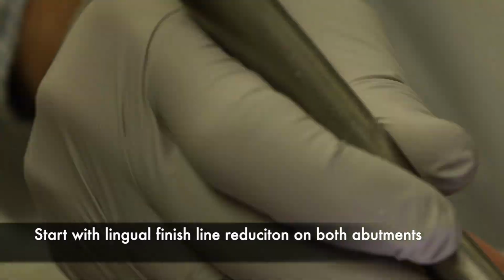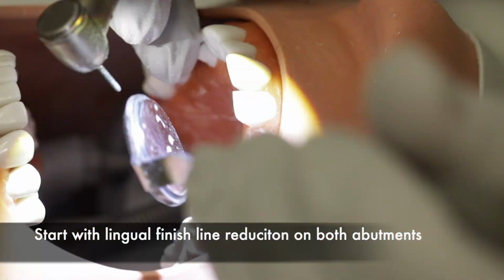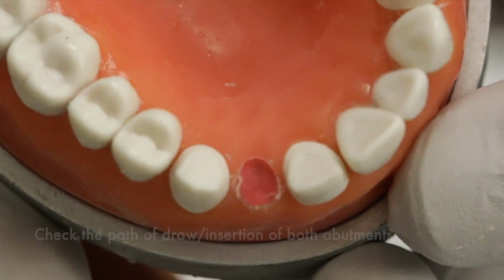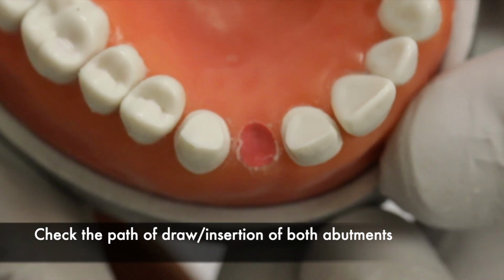After this, I go circumferentially around each abutment, and I make a finish line around each abutment tooth. You're gonna check again from the occlusal view, and again with one eye you should see the entire finish line of both abutment teeth at the same time.